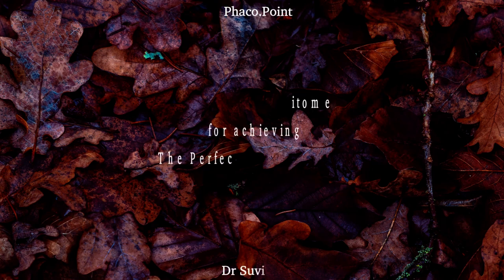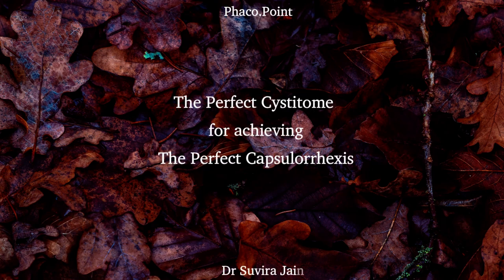In order to achieve a perfect capsulorexis, an extremely important prerequisite is fashioning the perfect cystitome. In this video I'd like to demonstrate the technique of creating the perfect cystitome, which is likely to enable you to achieve consistently perfect capsulorexis for your cataract surgical procedure. Let's begin.